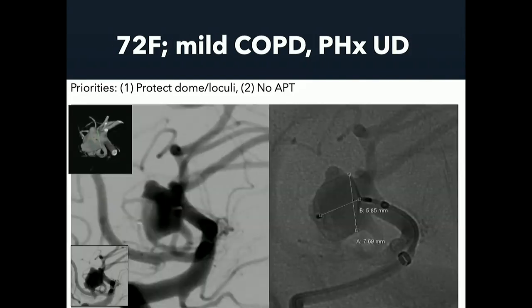And in fact, it did sit very nicely. This is about the 3rd case I'd ever done, and it actually landed not through any good management, but good luck. You can see the way it's sitting on the unsubtracted view on the right, preserving all those M2 branches. And on the left, you can see how it's already excluded the dome.